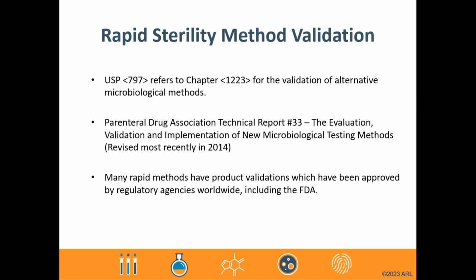To address one question that gets often asked to us here at ARL, and that is, does my state board of pharmacy allow for rapid sterility testing? Currently, most state boards do allow it, and we recommend that you check with your state board directly for more information.